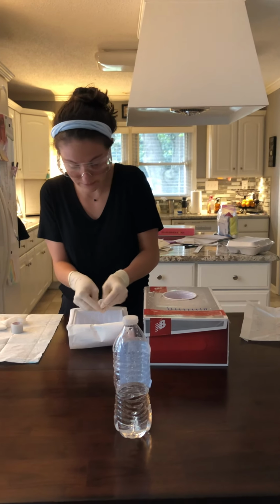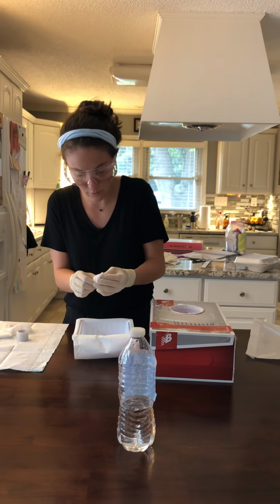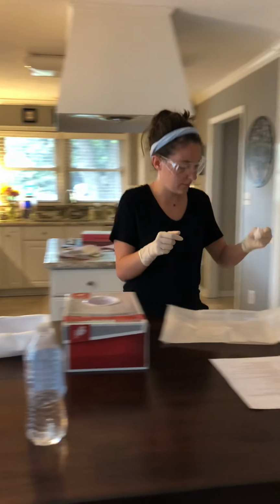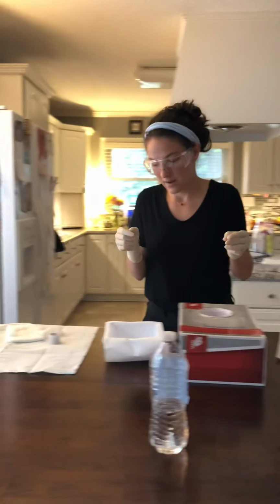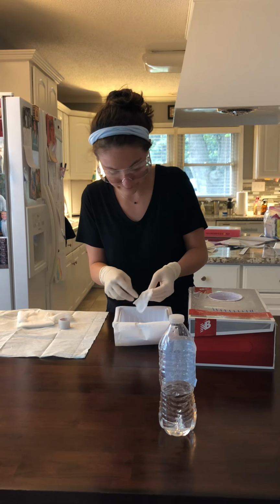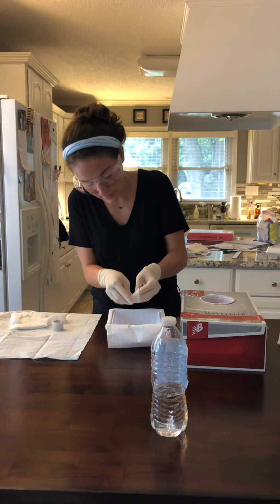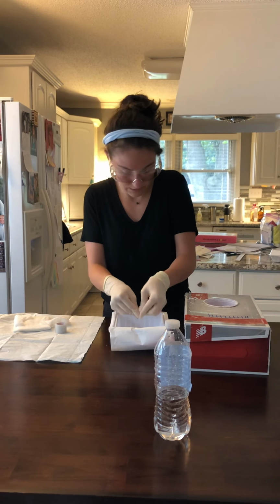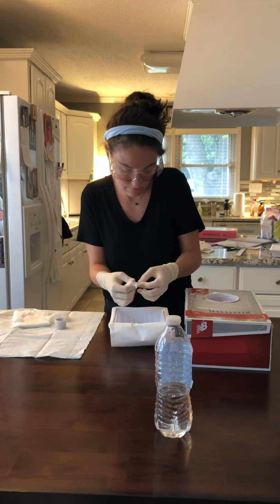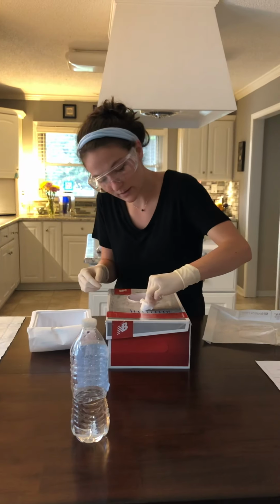Wring that out, not touching the sides of my tray. And I'm going to wipe down the left side and throw that away. And now I'm going to wipe down the right side. Careful, only to touch. Oh, I need to wring it out a little bit more. Okay. There we go. Perfect. And the right side.